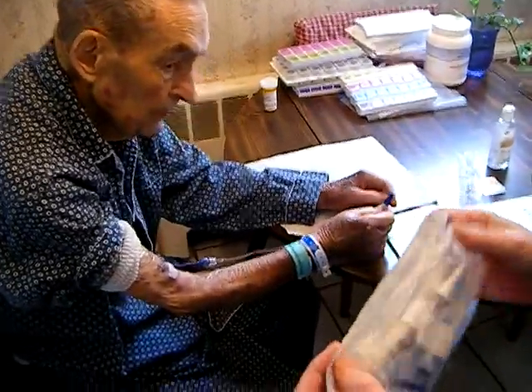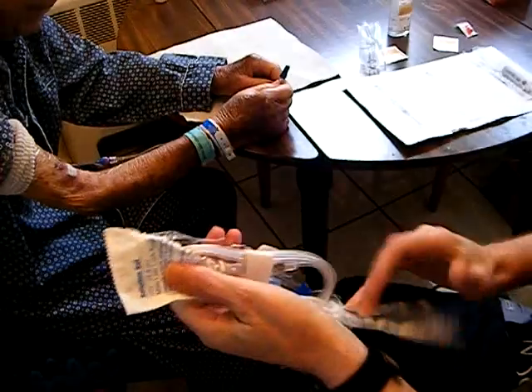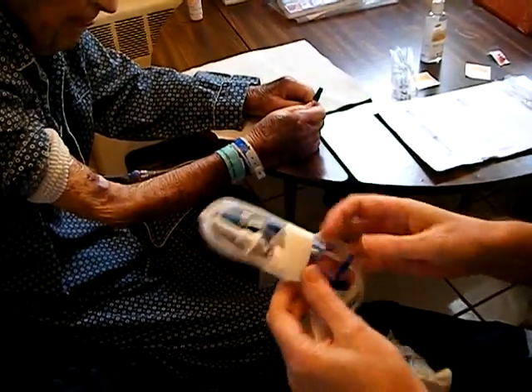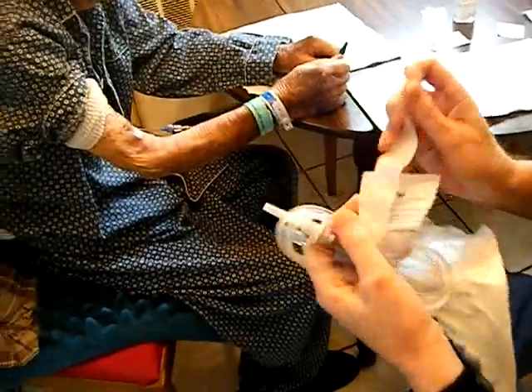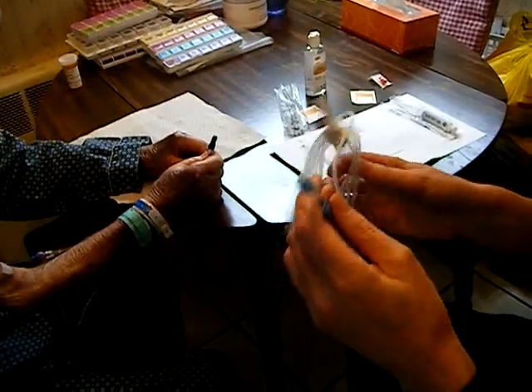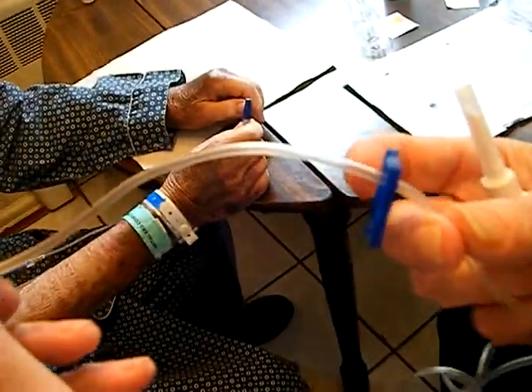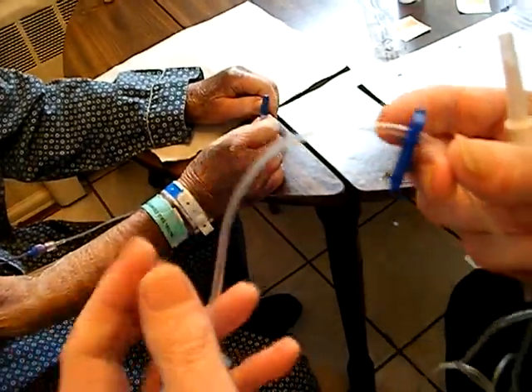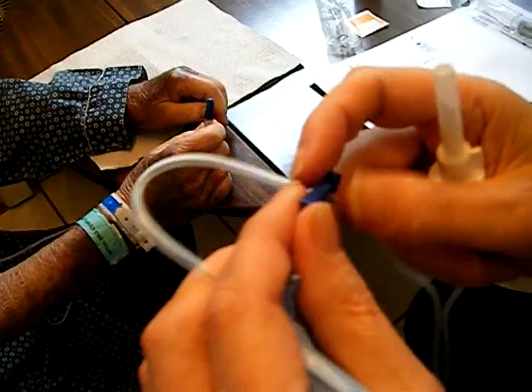Now we have the line that is going to extend. Here it is in the package — I'm going to open it up now and show you how that's done. This is the line, and I have a couple of important things to show you on it. This is not a complicated process, but it is a step-by-step process where a few minor precautions need to be taken in terms of it being able to flow down. Notice this blue clamp here — we have it in the open position. If we want it closed, we slide it into the closed position. But we want it open, so we leave it.